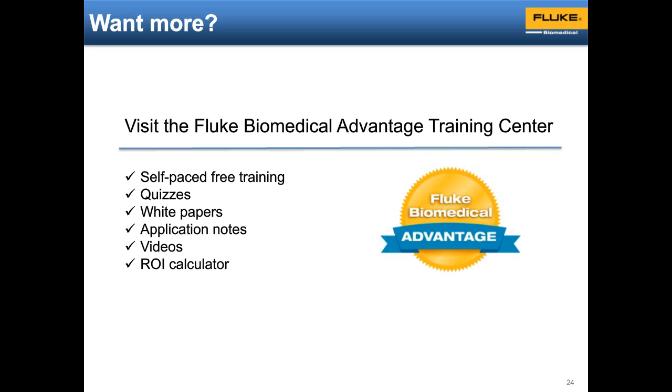Is there anything else you want to tell the listeners? Again, let's just be careful about a functional tester versus calibration and simulators. Right now, we can only test the R curves. We're not testing the entire system or anything like that. The other thing is to be very careful about the R curve and make sure that it's matching the sensor that you're using. Otherwise, you'll get inaccurate results.